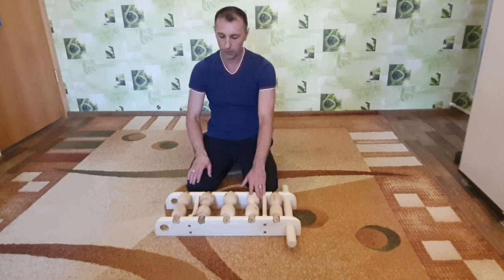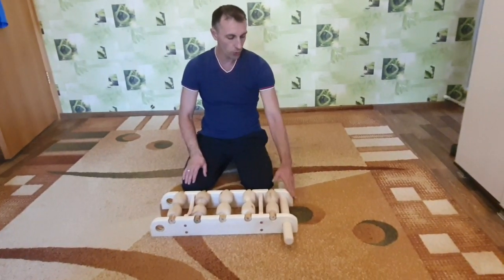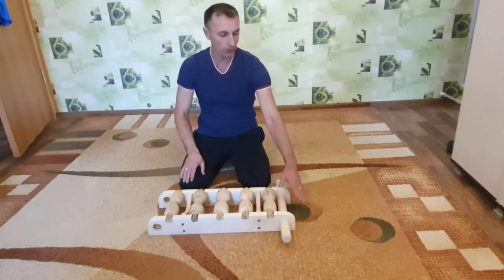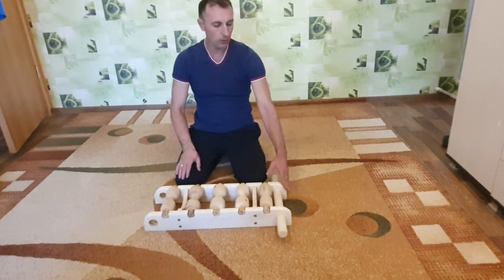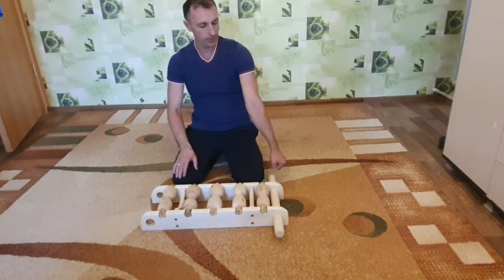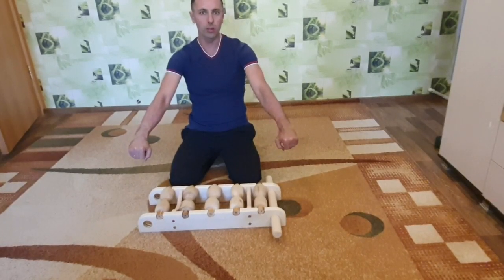Почему решено было изменить конструкцию? Объясняю. Несъемная ручка, которая идет вот здесь — она очень далеко. И ручка вот здесь где-то примерно, да? Ты когда лежишь, тебе надо тянуться к ручке.